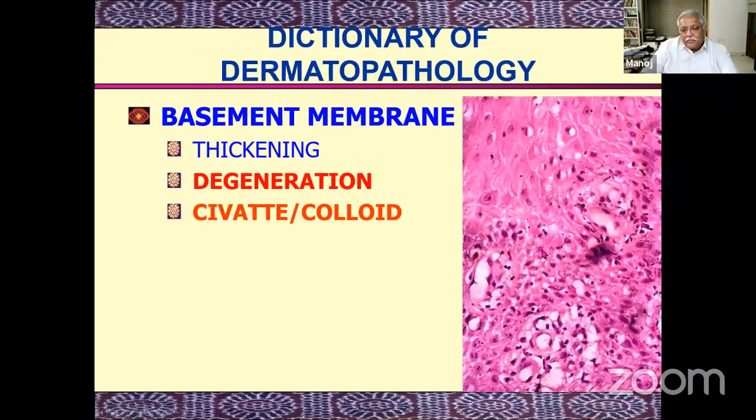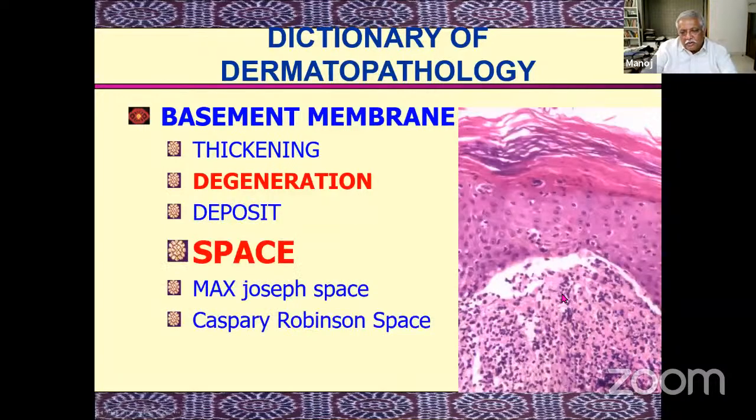So another very interesting feature which you see in lichen planus, particularly because of this huge inflammation here, it also affects the epidermis, right? And how does it affect the epidermis? It affects the formation and the maturation of these cells. As a result of that, you can make out that this is a small little photo from a lichen planus. The epidermis seems to be roughly kind of okay there. Granular layer is almost not there. There is a lot of hyperkeratosis, indicating that the cells are not separating. In other words, they're maturing very fast, not separating as much as they should be in the process of dying out.